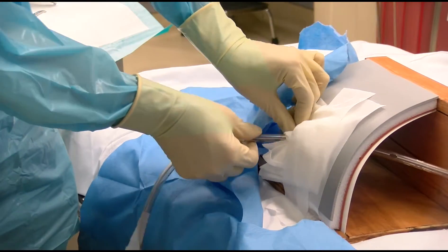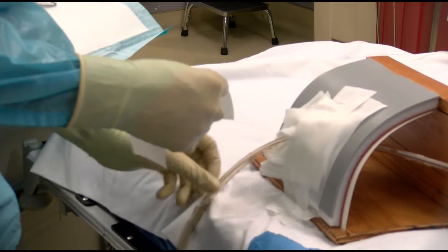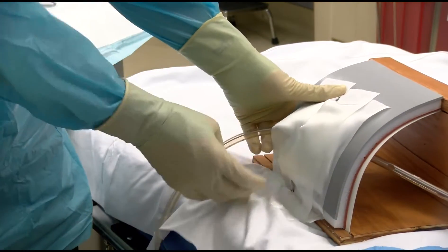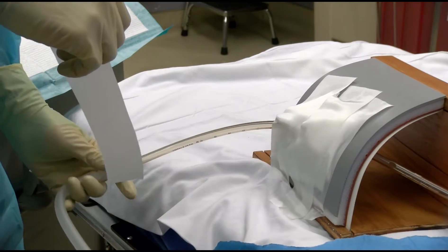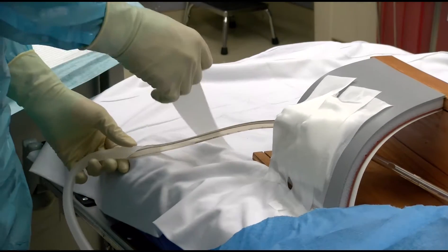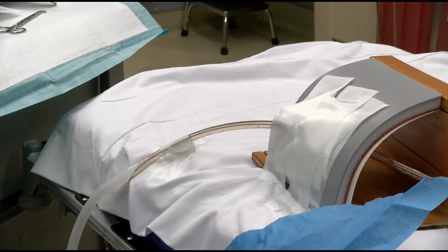Please ensure that a chest X-ray is taken to verify adequate placement of the tube after completion of the insertion. A tube can always be withdrawn if kinked or bent but should never be inserted further to prevent contamination or infection. A final piece of tape wrapped back on itself at the distal end of the tube can then be applied to the patient's skin. This is called a mesentery tape and can be useful to decrease the strain on the tube during patient transfer.